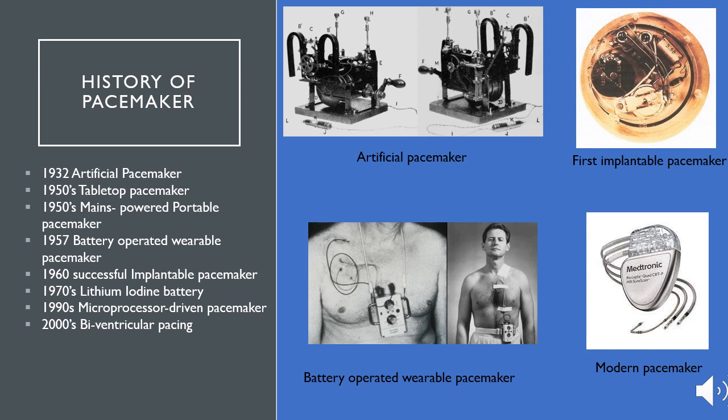It was operated by a hand crank and spring motor, which turned a magnet, known as the DC current generator, to supply the electricity. The device was used in the New York area, however, it was not accepted by the medical community. Eventually, his work was derailed by technical problems and the attitude of the times.